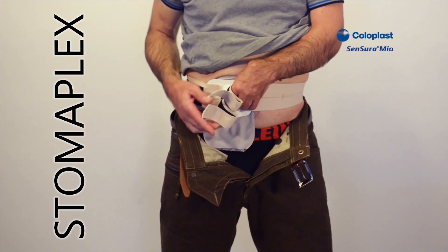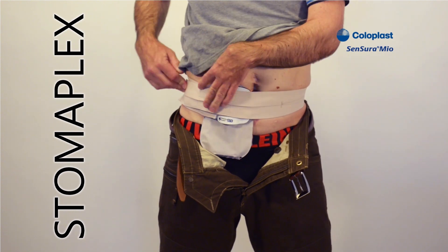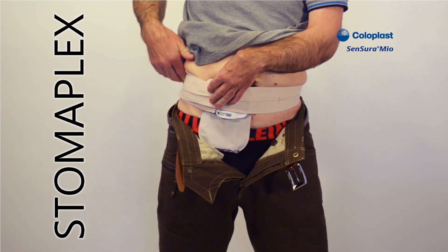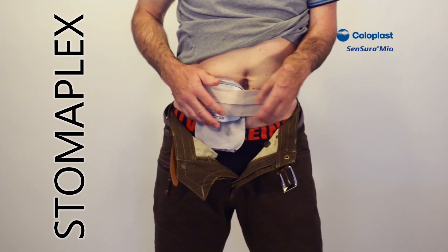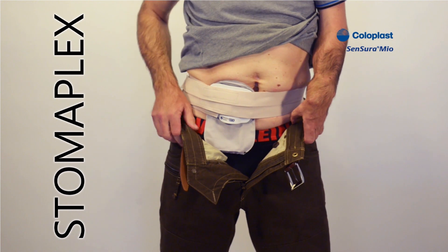Bring the two straps around, pull them and fasten them to the outside of the belt independently. The guard is positioned and it stays in place very nicely by the tension of the belt.